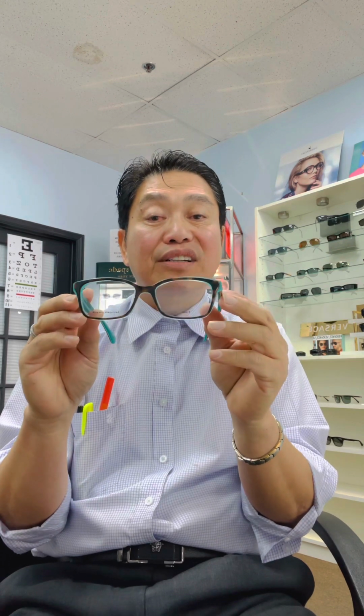The second material is plastic frame. Plastic frame is also a very strong frame. It will also handle the daily abuse of wearing eyeglasses. And the good thing with plastic is they do come with a lot of colors. Let's say, for example, this one here, the back of the frame is a turquoise color, and on the side and on the front here, it's a black color. So this is a plastic material.